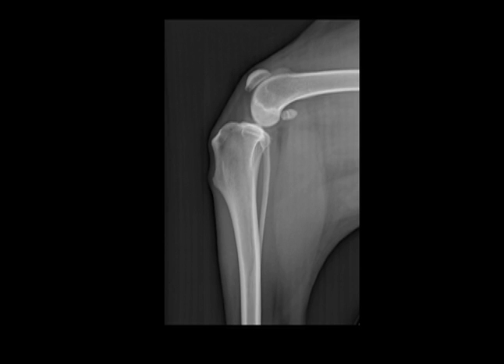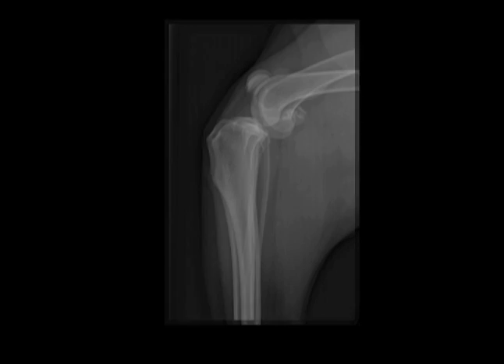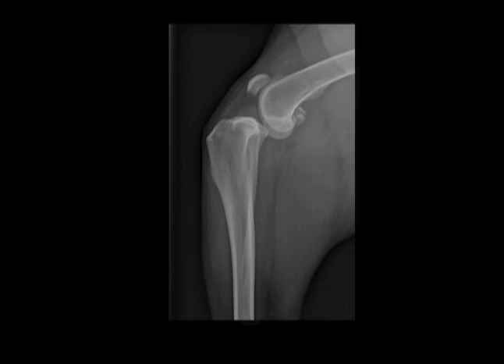One other way to illustrate is with a set of x-rays that we have. In this patient, during weight bearing, the femur slides down and back, and that downward, backward sliding motion is what tears the ACL. It's what creates the chronic biomechanical stress on the ACL, and it dictates a lot of things. It dictates how dogs tear their ACLs, because they usually do it little by little by little with this biomechanical degeneration. It dictates why they need repair. It dictates why most surgeons have abandoned old style repairs, and it dictates why we do tibial plateau levelings because of that problem.